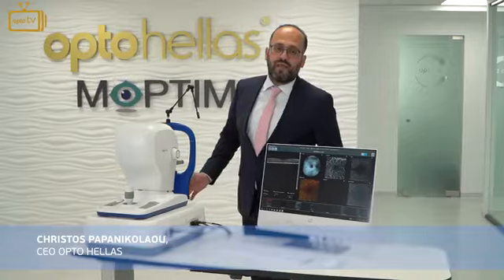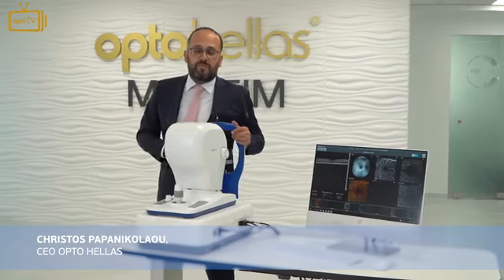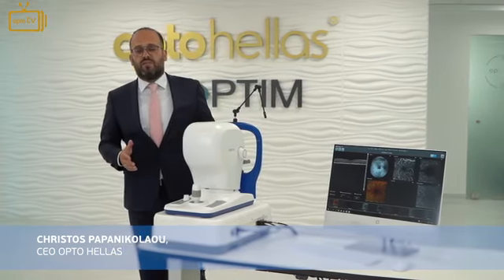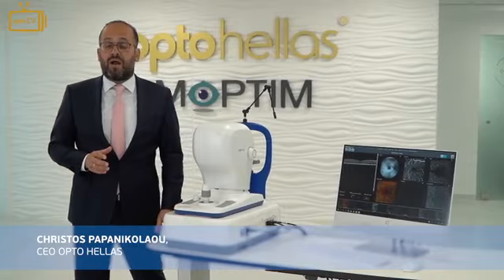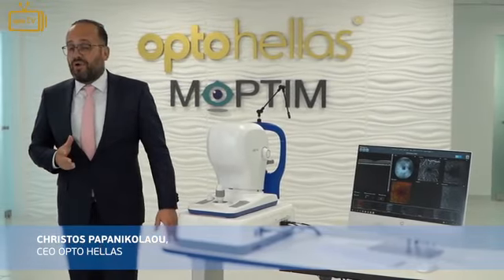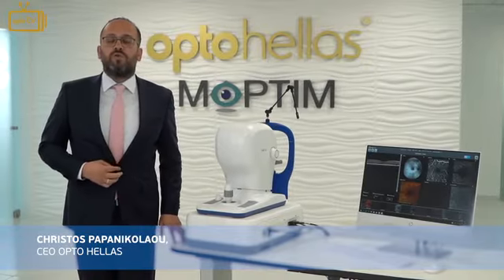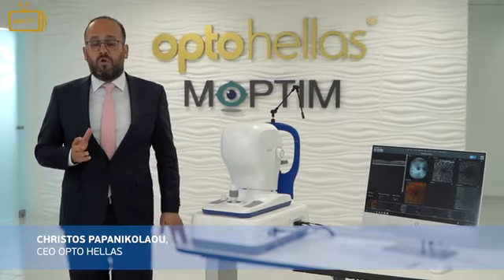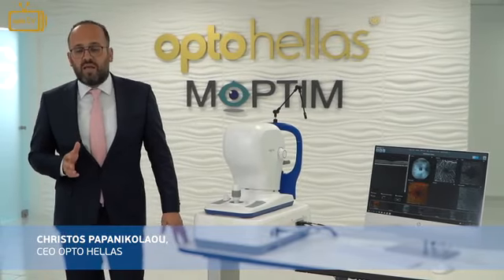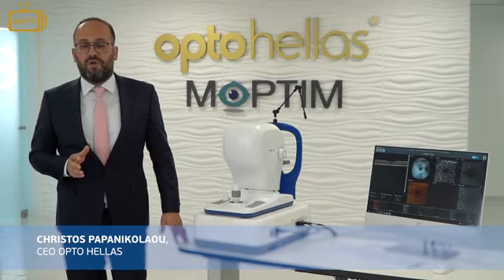We are honored today to introduce you the first video user's guide for the MOCEAN high-definition widefield spectral domain SLO OCT with VASCAN optical microangiography, the new market changer. In cooperation with Dr. Michalis Arvanitis, we are here to show you all the new features, the new specifications, and how to operate the OCT for achieving high-quality images and high-quality results for your diagnosis.